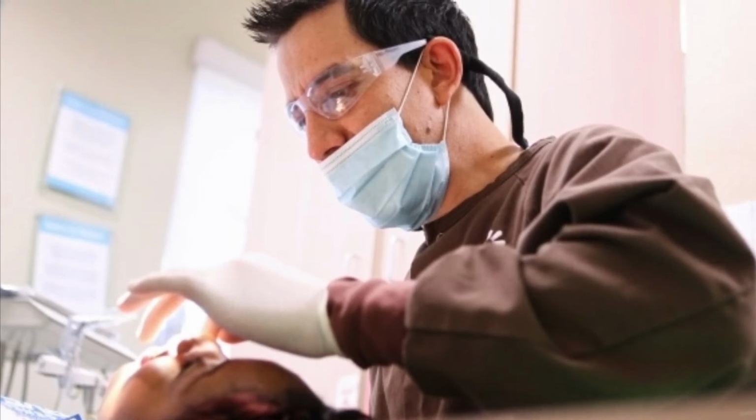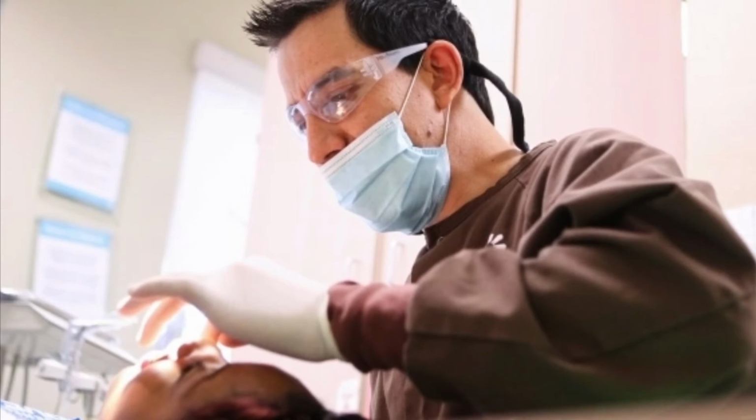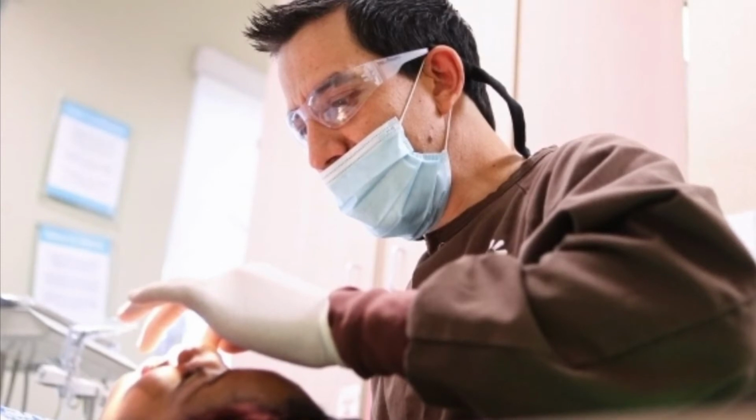Again, the objective is to establish the length of the tooth at which the canal preparation and subsequent obturation are to be completed.